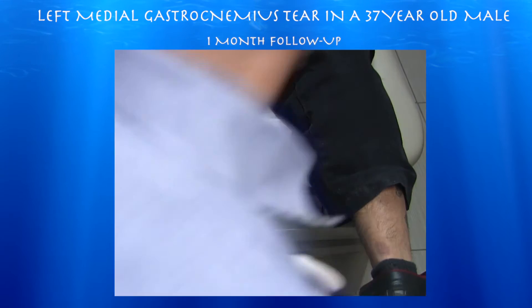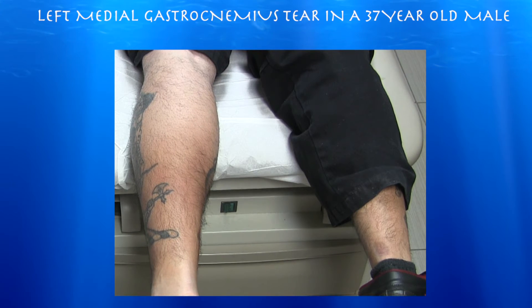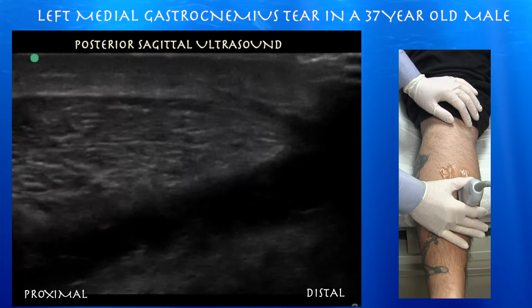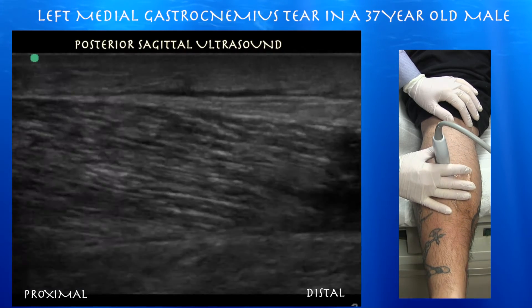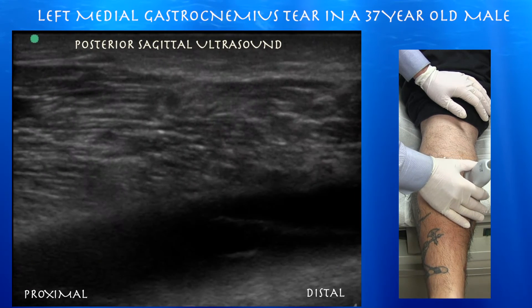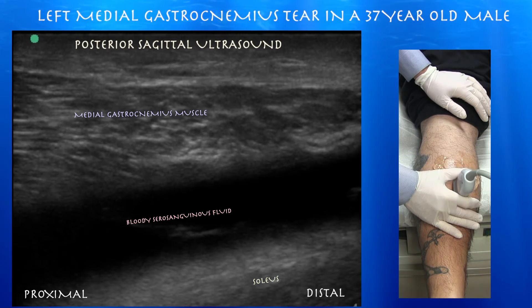We're about a month out from the tear of the left medial gastrocnemius muscle, doing a follow-up ultrasound to see if the hematoma has resolved. This was a surprise — he was complaining of swelling distally and some stiffness, but there's a very large layer of fluid between the medial gastrocnemius muscle and the soleus muscle, with blood spreading the plane between those two muscles.